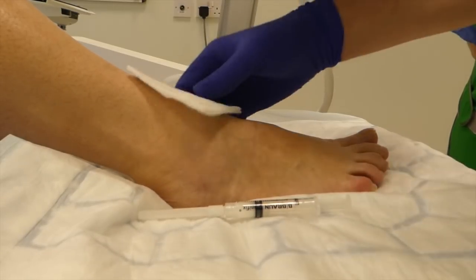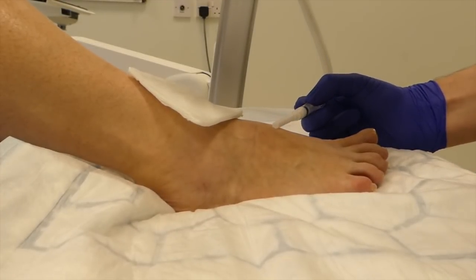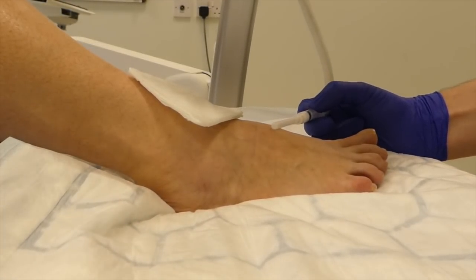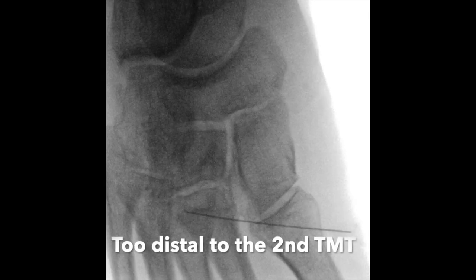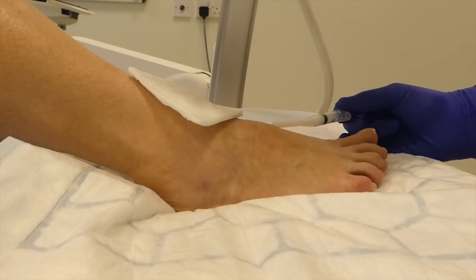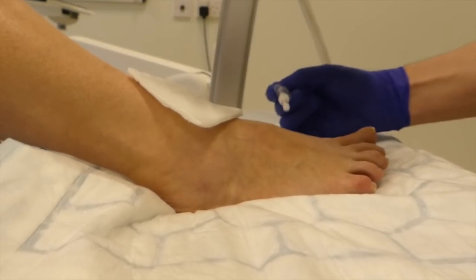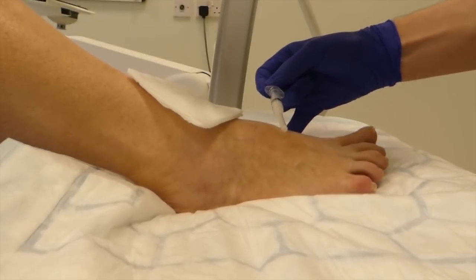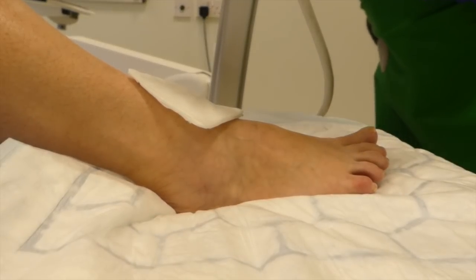So we'll do some still images from the x-ray machine. Keeping your hand out of the way, first off we'll just do a little check. I've got a student with me in theatre today, so I'm speaking to my students as well. Louise, you can see the needle coming in from the side. I'm a little bit medial, so I'm going to come in from that angle. It's just a little bit distal to the joint — you can see the second metatarsocuneiform there.